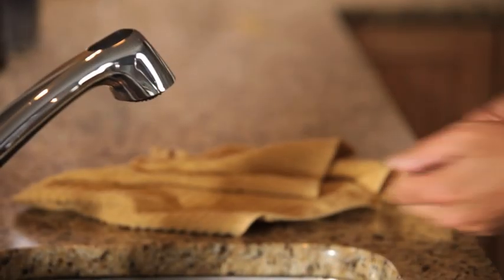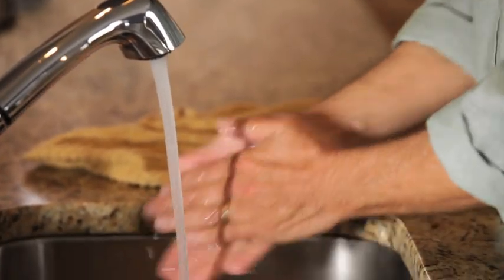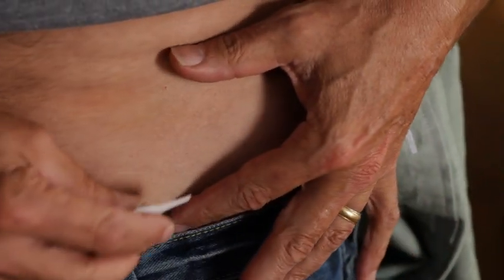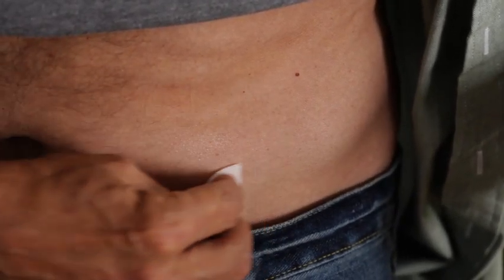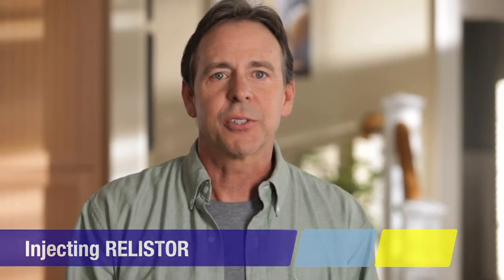Once you decide where you're going to do the injection, wash your hands. Now clean the injection site with an alcohol swab by starting in the center, applying pressure and cleaning in a circular motion working outward. Let the area air dry and don't touch it again before giving the injection. Now you're ready to prepare the injection.